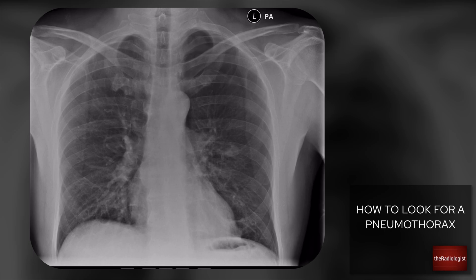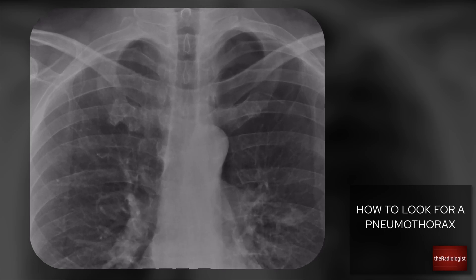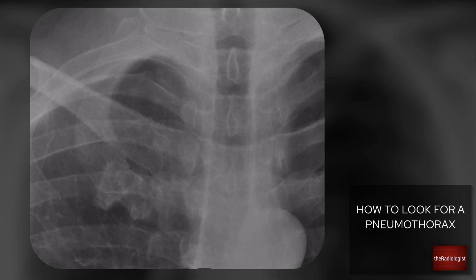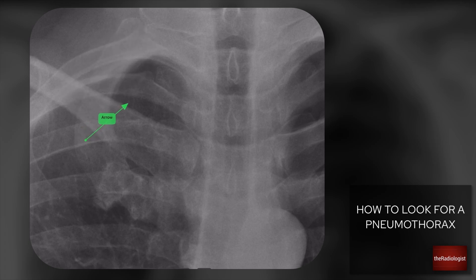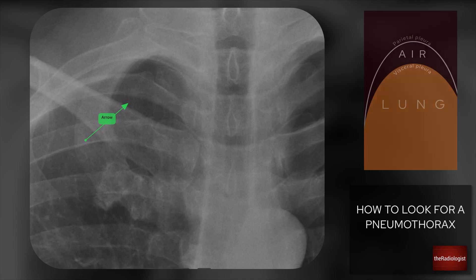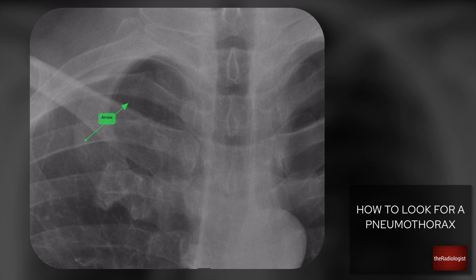Here's another case. Looking first at the right apex, I think I can see lung markings and I can't see any pleural lines. With a pneumothorax, the visceral and parietal layers separate and you should be able to see the visceral pleura as a thin white line paralleling the chest wall. I can't see any evidence of that here, so no pneumothorax on the right.